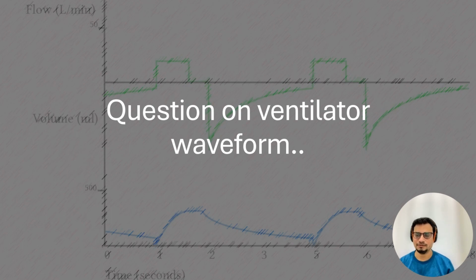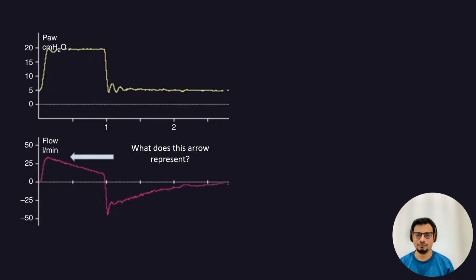Today I have brought a brand new question for all of you related to ventilator waveforms, and it is important for everyone who is interested in critical care medicine or who is an exam going. Alright, so let's start without wasting any time.